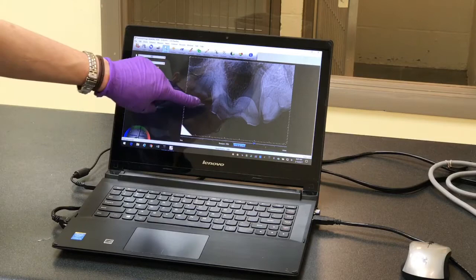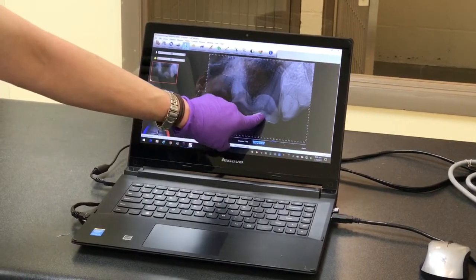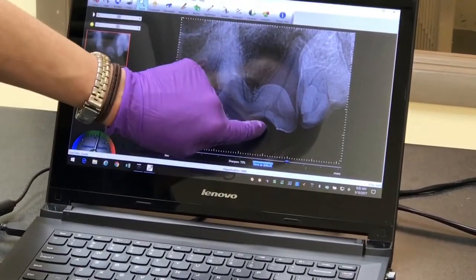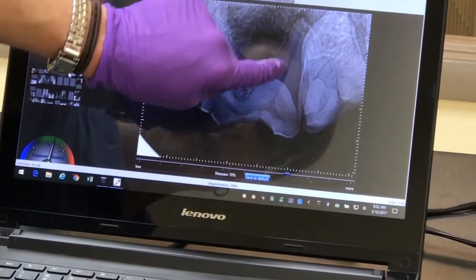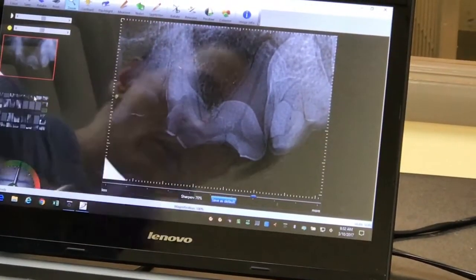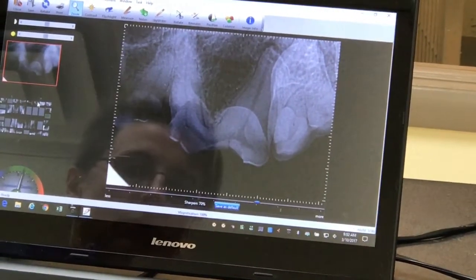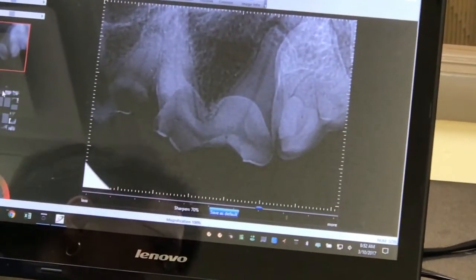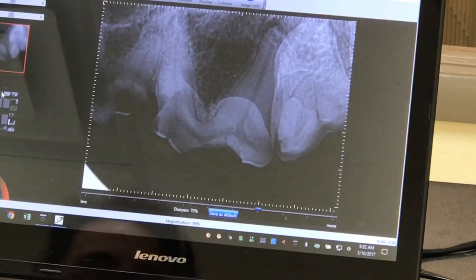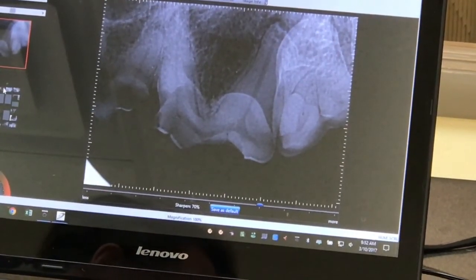So this is compared to the pre-extraction x-ray, and again you can see the large defect right here, right there, and you can actually see where it enters into the pulp canal, the dark lines that go down each fork or root. So that tooth was destined to be extracted based on the trauma it sustained, more than likely again from chewing on something way too hard. Let me re-emphasize those things to be antlers, hooves, nylon bones, pork bones, beef bones, and rocks.